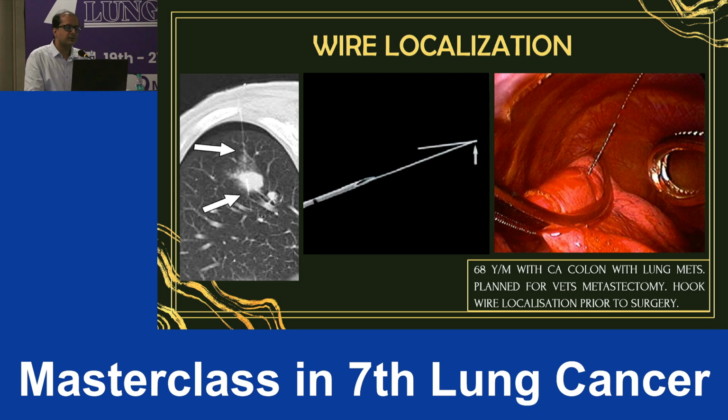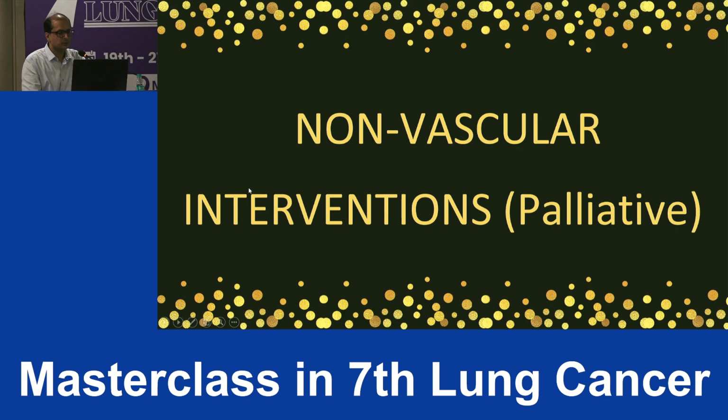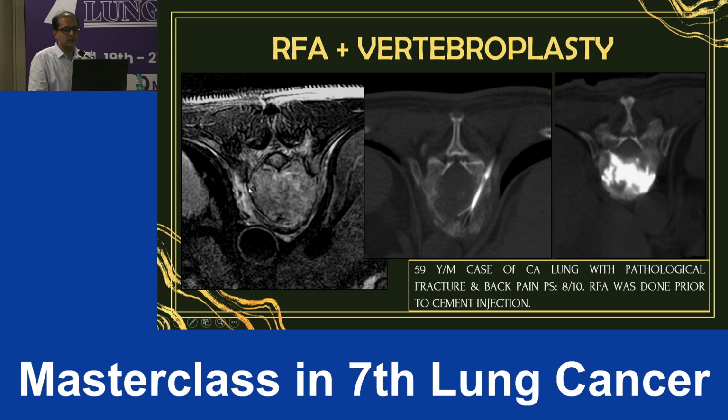Again, the surgeons many times would not be able to palpate the metastatic nodules either from CA lung or from colon. It would be difficult. That is the time where we place hook wire localization, and this is what the hook looks like. We place it under CT scan guidance, and this is the thick part which is palpated by the surgeons. Endobronchial ultrasound has already been covered by Dr. Amit in a very concise way.